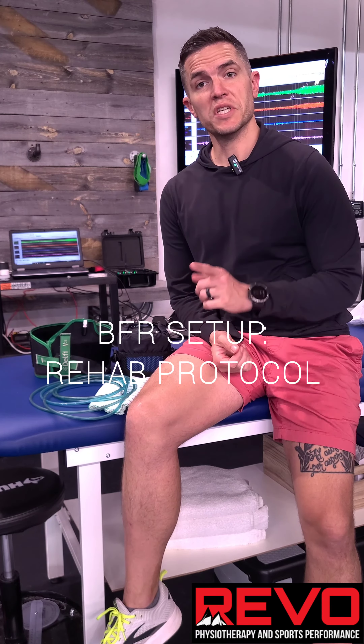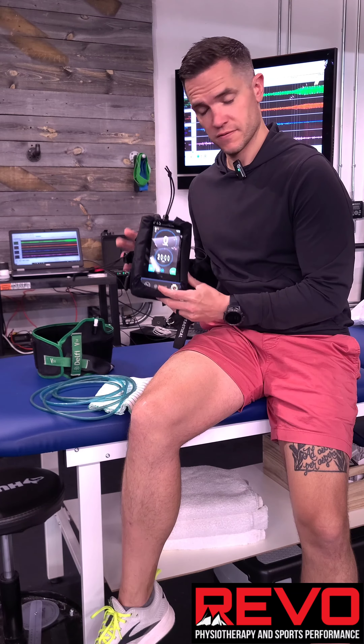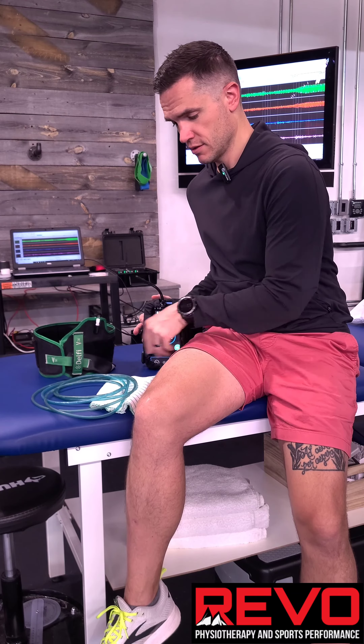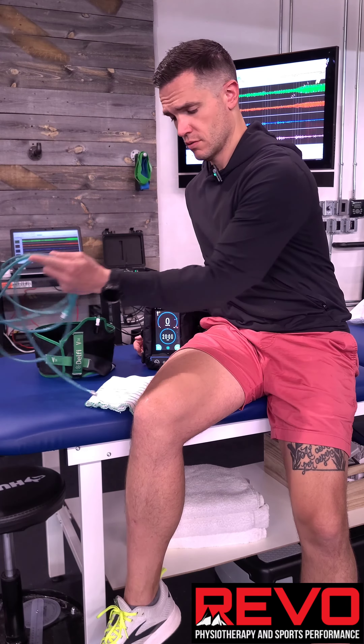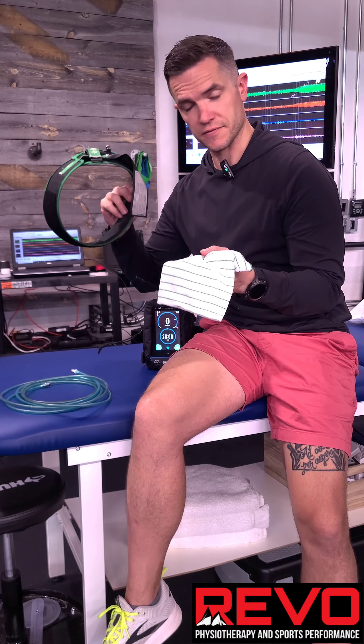To get our BFR unit set up, you need a few things: you need the machine itself, the little black jacket that it goes in so it doesn't break, you need the hose, you need a sleeve, and a cuff.